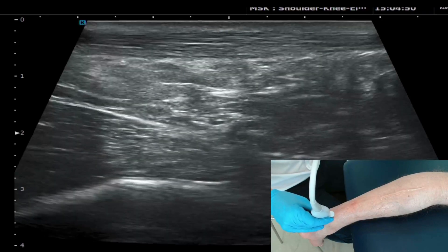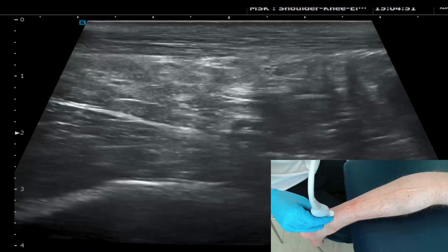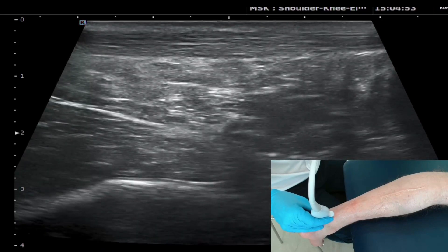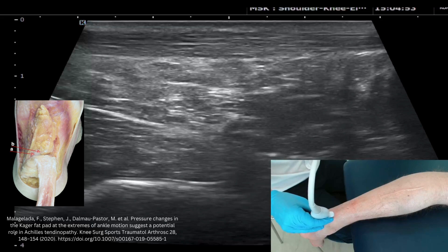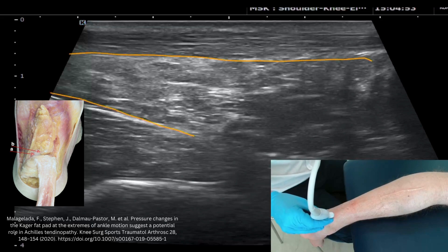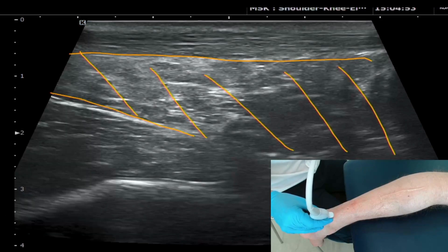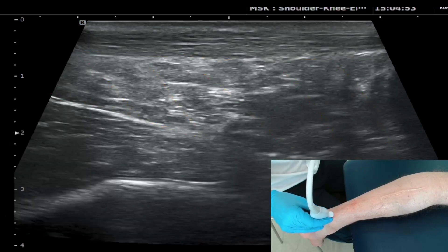If we drop the depth a little bit more, and even go to a convex view if you have that option, you can see the size of the Kager's fat pad and how far proximal it tracks up deep to the Achilles tendon. There's a nice cadaveric image illustrating that.